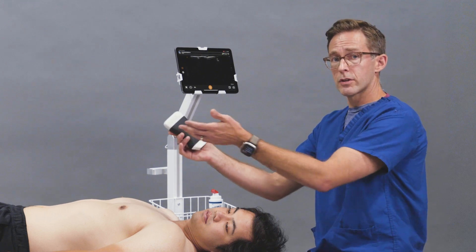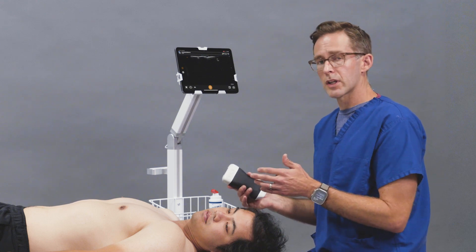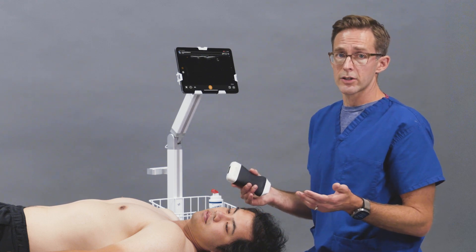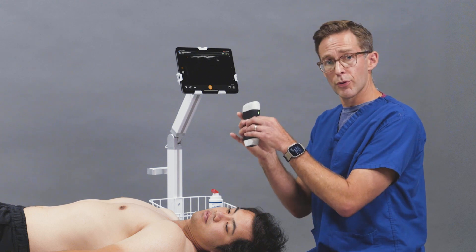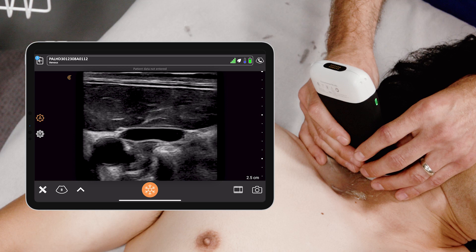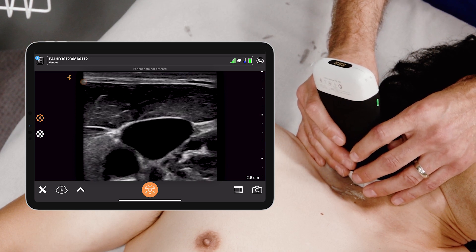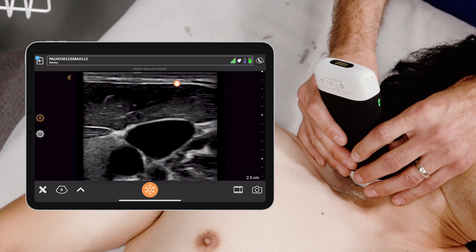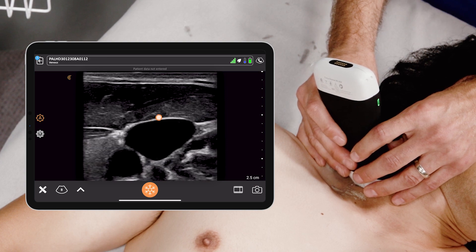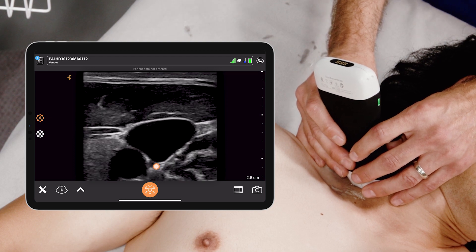You have the patient supine and the head rotated laterally. Typically we'll be doing a right IJ, but you can certainly do a left IJ as well. You're going to take your probe and place it on the side of the neck like so. What you'll immediately see is the sternocleidomastoid on top, and you'll see this large triangular structure that seems to be varying with respiration, and that's the internal jugular vein.